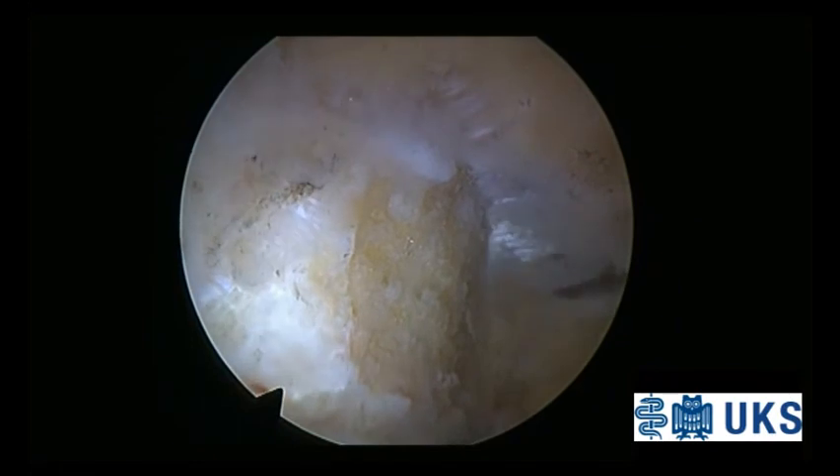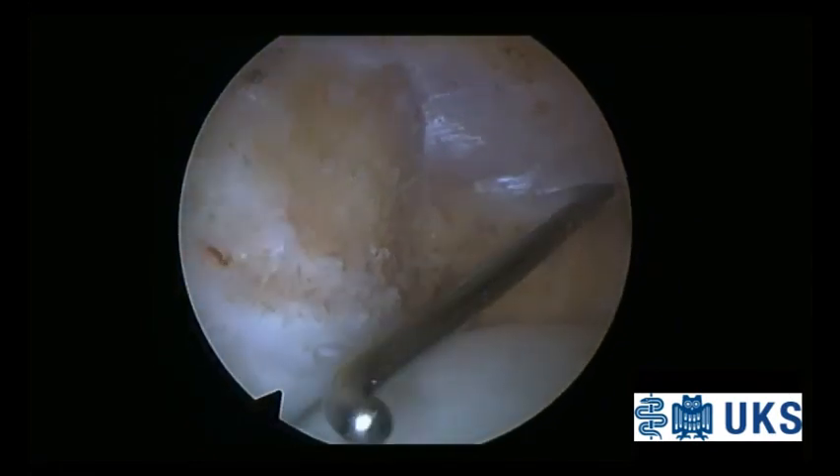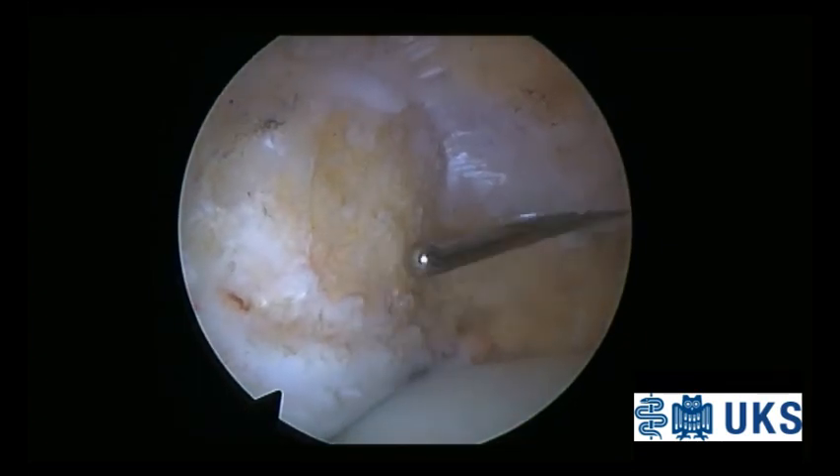Finally, a detailed joint lavage and wound closure is performed. If required, an intra-articular drainage is placed.